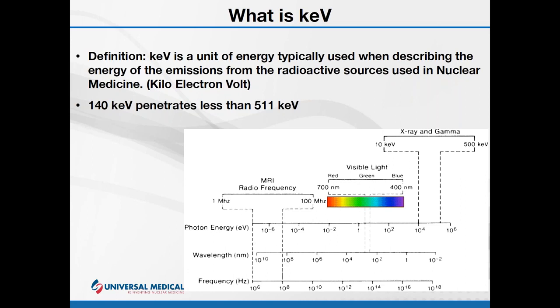If I think of the isotope that is most common, technetium-99, it can penetrate aluminum, as we described before, but a moderately thin piece of lead will be enough to stop it, because lead will stop a certain energy worth of isotope or a certain keV energy. Now, if I was to take FDG or fluorine-18, which we're talking about 511 keV, it's going to take a much, much thicker piece of lead to stop 511 keV energies.